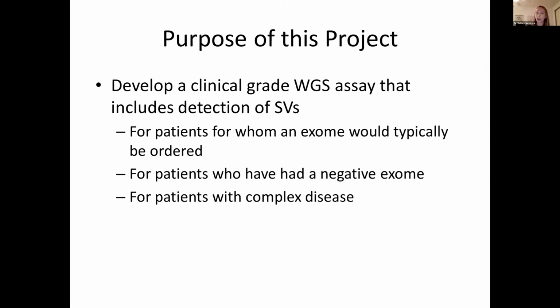So today I'm only talking about the structural variant portion, but we also are validating the whole genome sequencing for detection of single nucleotide variants as well as small indels, and then layering on top of this, detection of structural variants. This is really for patients who would typically have an exome ordered, but in this case now they can have the added bonus of getting structural variants detected within a single assay.